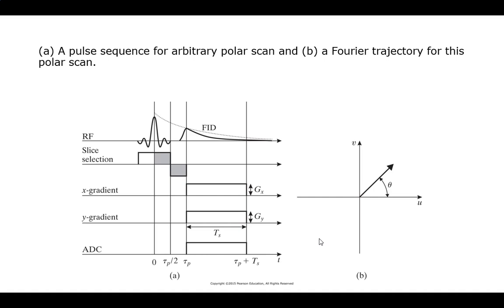Amazingly, sample time does relate to your frequency domain, and they are inverse. So when you say they're inverses, does a longer sample time give you a larger sample in K-space? It gives you a larger distance between the useful data points you're getting out. Okay, that makes sense.